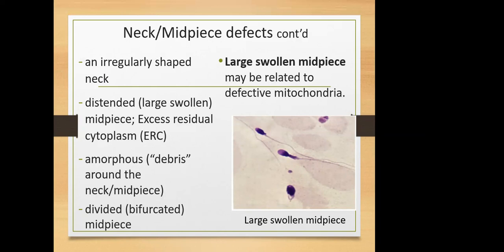As you move along, you realize, why is it abnormal? Remember that we said that at the spermiogenesis stage, we expect the unused organelles within the cytoplasm to be extruded. You remember the cytoplasmic extrusion. Be extruded so that the Sertoli cell will mop up. Sometimes you don't get it completely extruded, so it retains a small amount, which is acceptable.